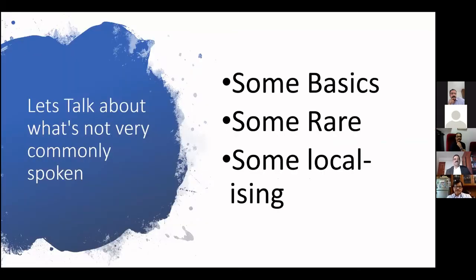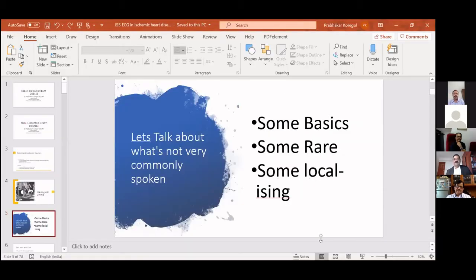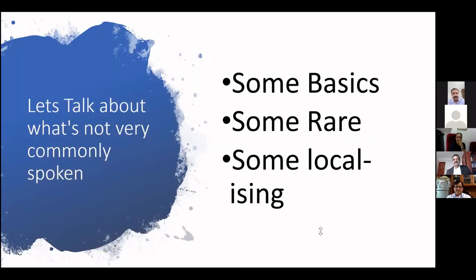So what I'm going to talk about is some basics, some rare ECGs, and something a little local, or what I would say is a localizing of the ECG values.